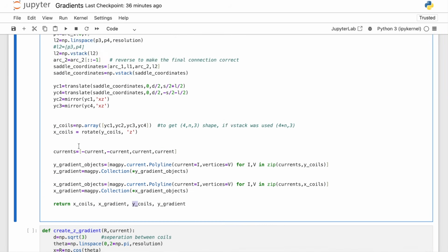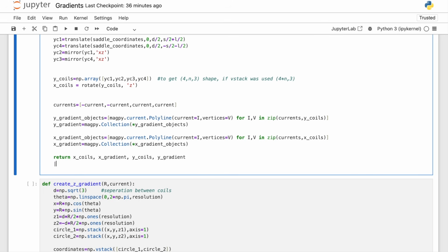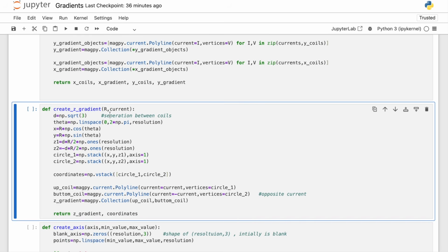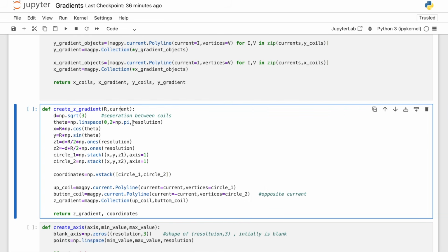So after we understood this function, we can run this. And then we have the create z gradient function, which just takes r and current. This is simple enough. So the distance between the coils, or the separation, is just square root of 3 times r. Here we can see that. So z1, which is the z coordinate of the top coil, is d times r over 2, and z2 is minus d times r over 2. Again, why r over 2? Because I want it to be centered around the origin.